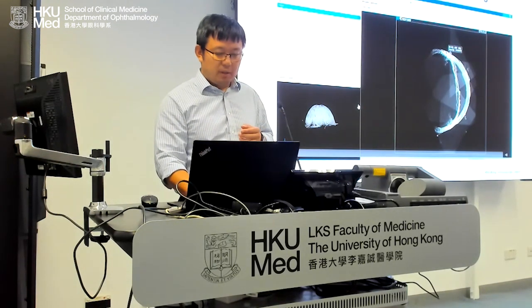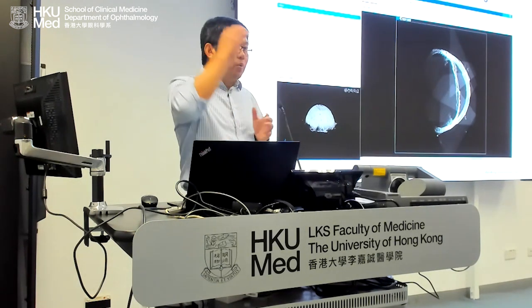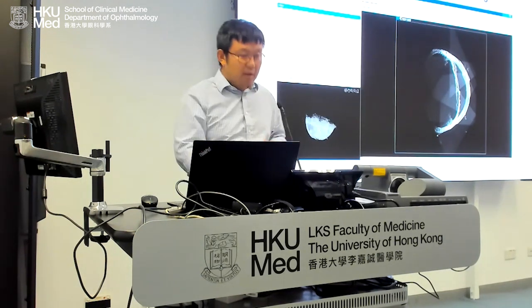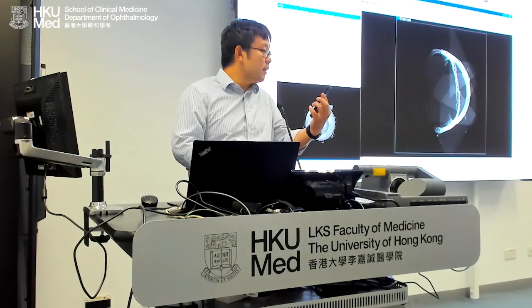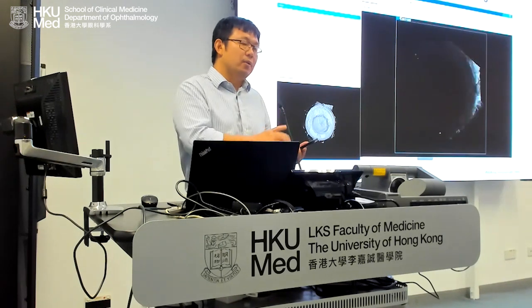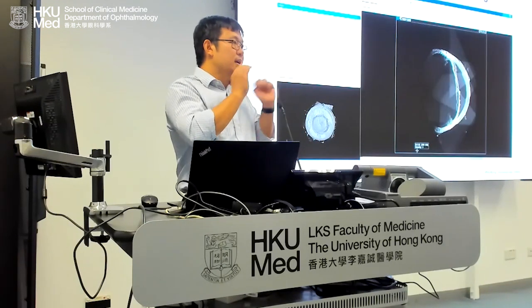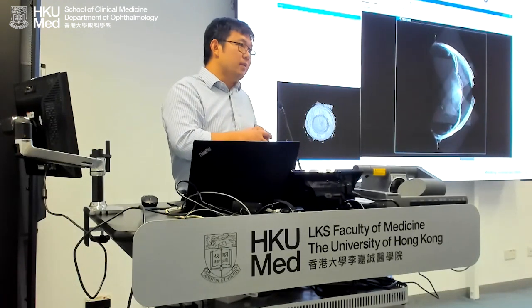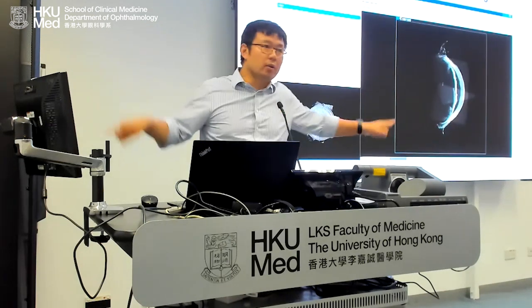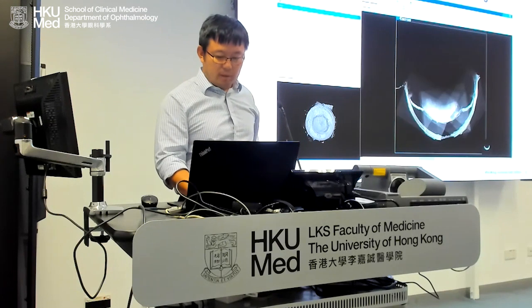So Raymond showed me a so-called point cloud registration. What is point cloud registration? For the new phone, when we look at the camera, the Face ID can unlock the phone. What is Face ID? They actually use lasers scanning the face, with different point clouds being captured. Similar to the autonomous driving of Tesla, they have laser scanning around all the locations, get the point clouds, and then register them. So we're trying to mimic the same thing.